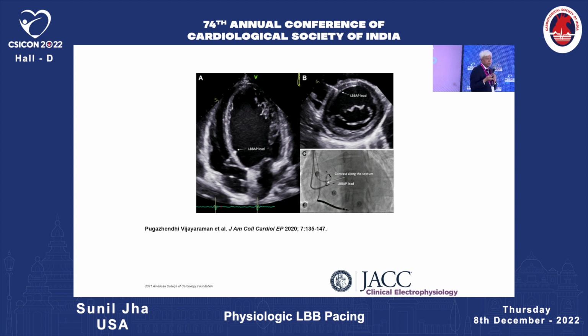If you have echo, well, we have portable echo in the lab. You can quickly see this. We don't do it routinely, but initially when we started doing it, we used to see it more often and make sure that it is not crossing the septum here though.